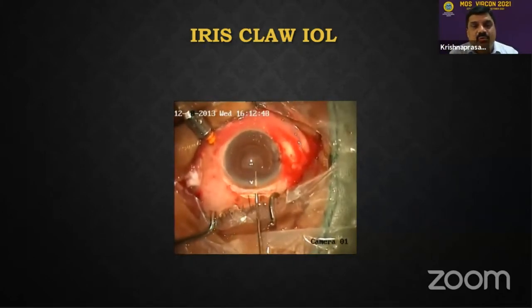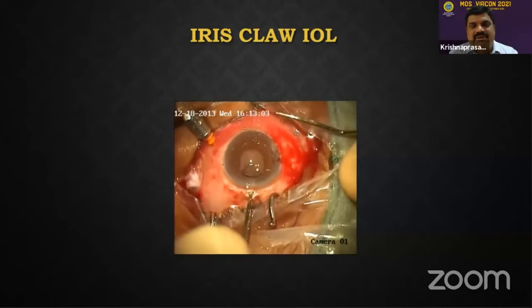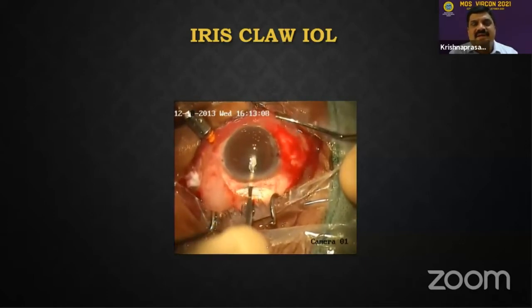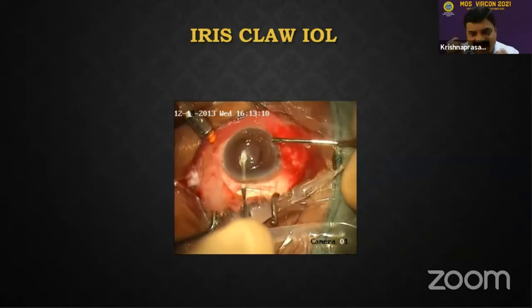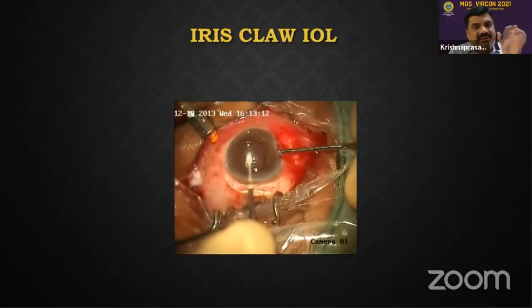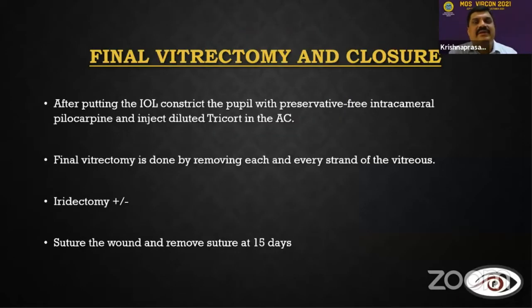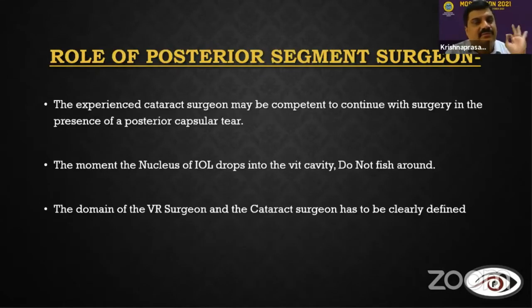Then see how well the lens is staying; the positioning of the lens is very important. Hold it, go from the paracentesis, go underneath the iris, and clip. The iris will clip behind the lens. So final anterior vitrectomy closure is very, very important. But one fine point I want to tell: whenever there is a rent, make sure that you do a good vitrectomy, and one suture has to be put at the end of the surgery. You can remove that suture after 15 days.